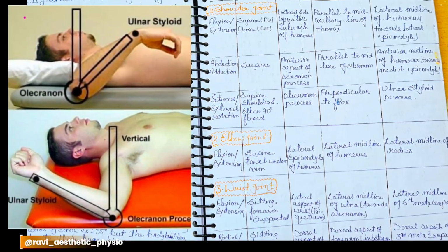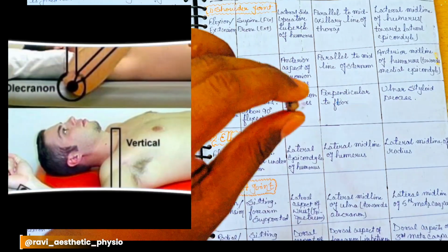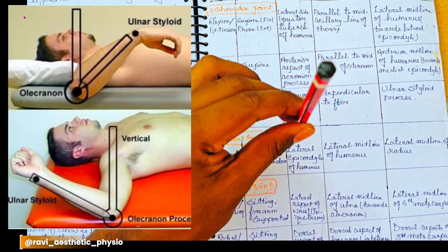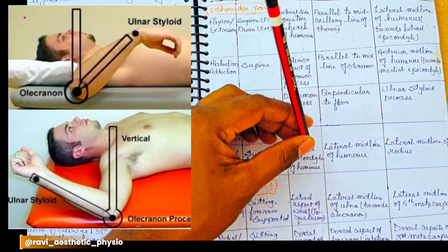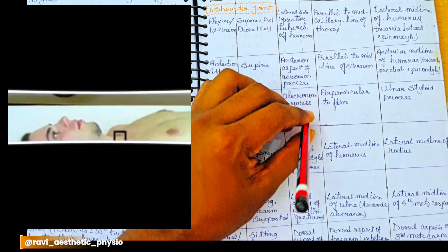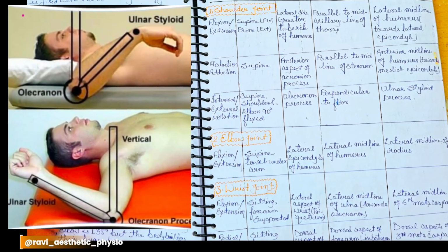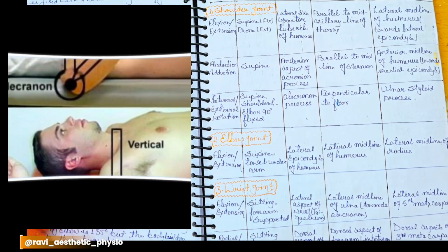The movable arm moves with the forearm, either in external or internal rotation, parallel to the ulnar styloid process. It will move with the ulnar styloid process. So you can identify the range, 0 to 90 degrees, for external or internal rotation.